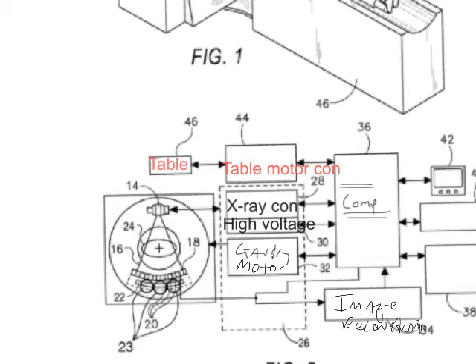And then the other stuff off to the side, like 40, is just the operator console. That seems like a no-brainer to me, that I have to have a keyboard or some way to do things with this computer. It's obvious, but you need to indicate there's an operator console. And the other thing that seems like a no-brainer, there needs to be mass storage. So 38 is mass storage.